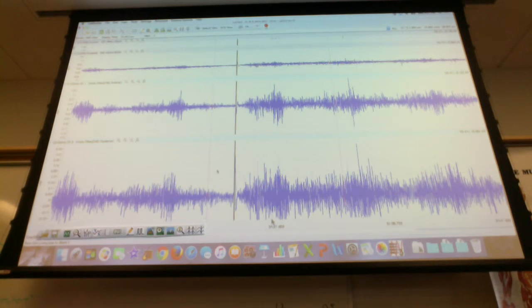Okay. So, you guys observed it. Now, the last thing I want to do, none of these things really directly involve the tricep as a particularly good agonist, so we're going to try to do something that does that. There's two different things you can do. One, you can do a dip, right? So try to lean back, keep your butt down, and then do a dip.